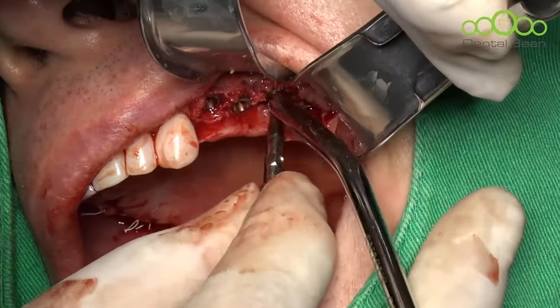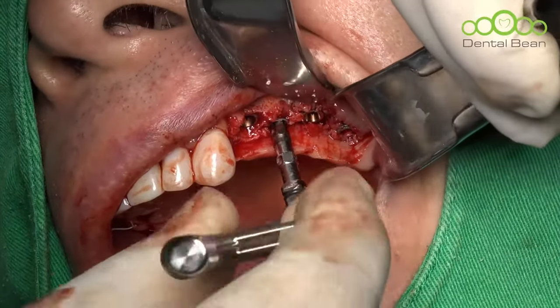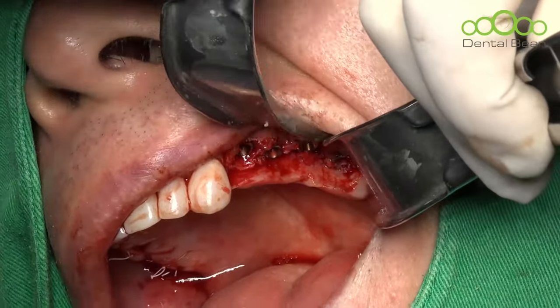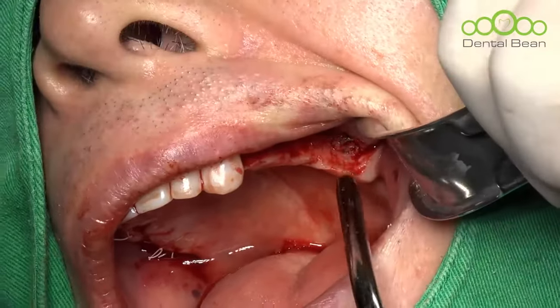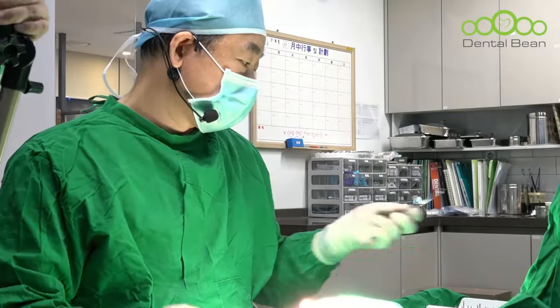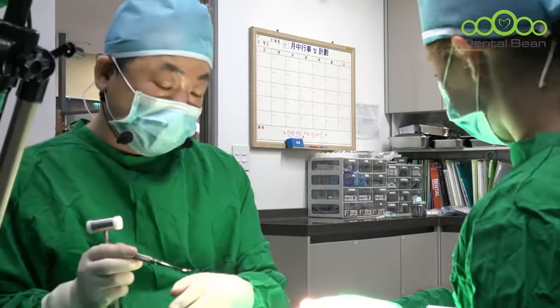Here's a minor defect. Dr. Kim asked me to do alveoloplasty at number 8. So I'll try this. Osenbein chisel. Osenbein chisel. He asked me to reduce the maxillary tuberosity. Then I will try.